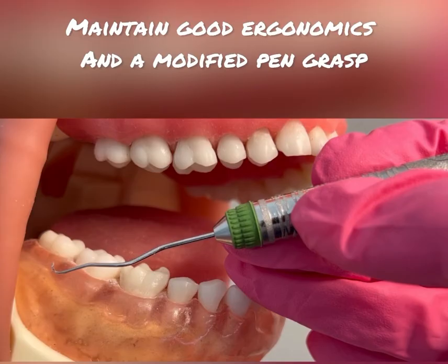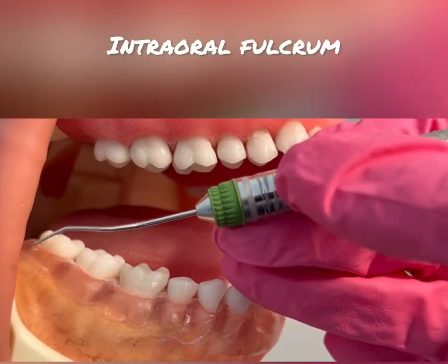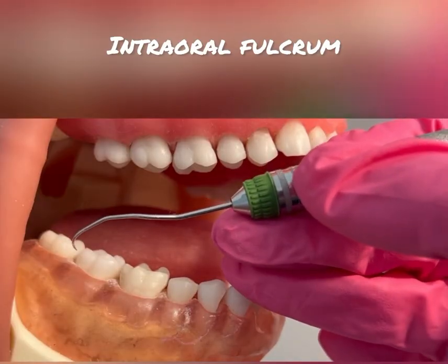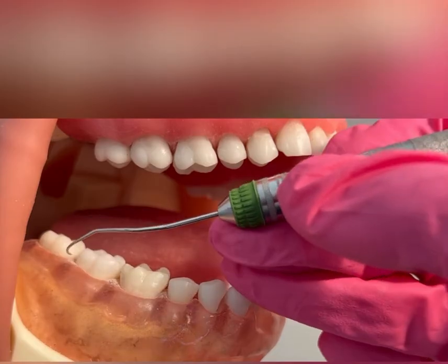Make sure you have good ergonomics, a modified pen grasp, and an intraoral fulcrum where you will be fulcruming on an occlusal or incisal edge one up to four teeth away.